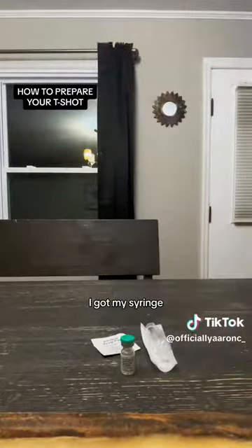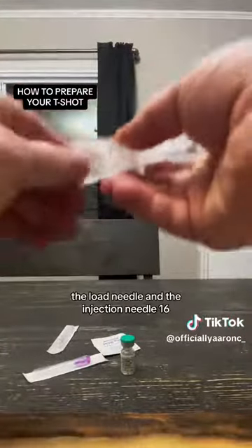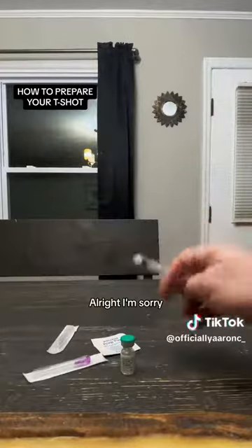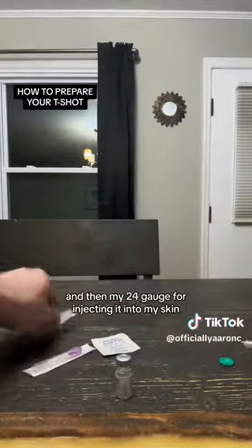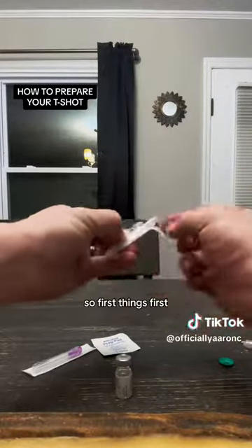First I got my vial, I got my syringe, I got my alcohol prep pad and my two needles — the draw needle and the injection needle. 18 gauge for my draw needle and then 24 gauge for injecting it into my skin.